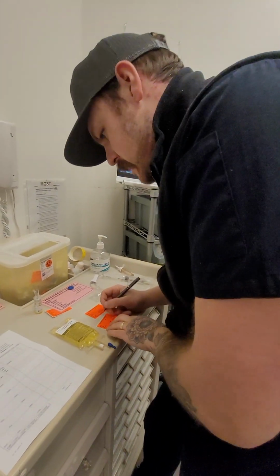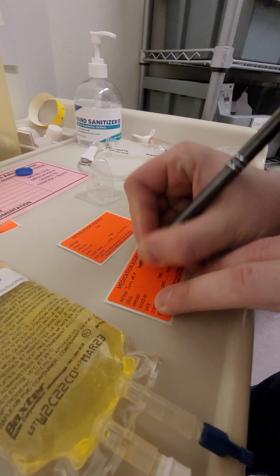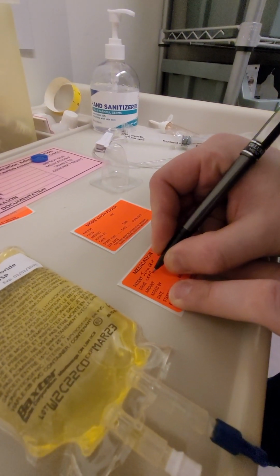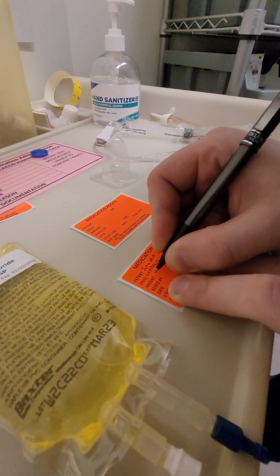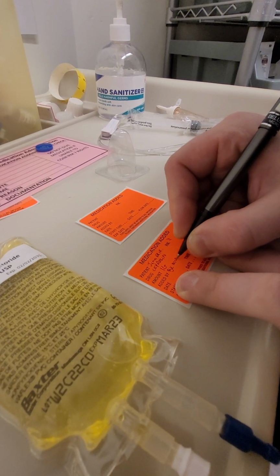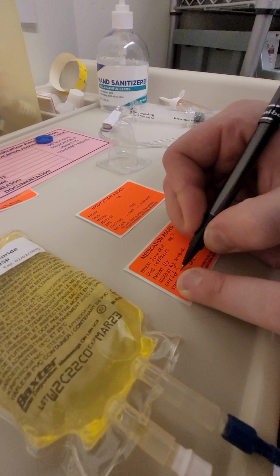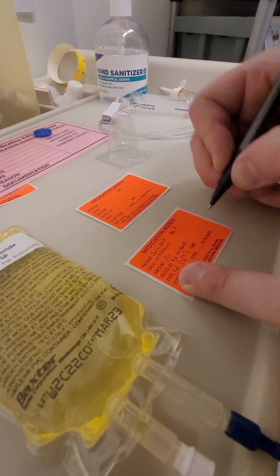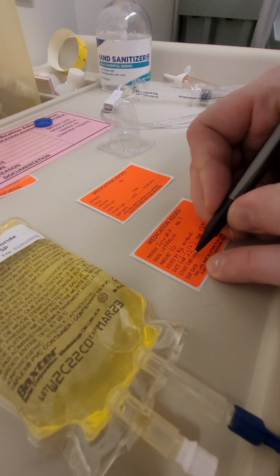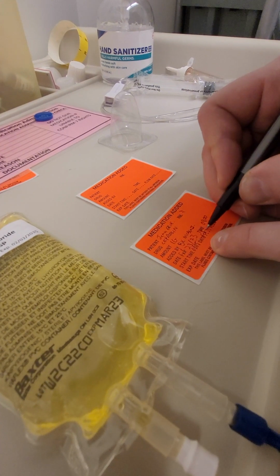So let's fill this out. So we've got generic here. Room 3, drug. We're going to be using cefazolin today. 1 gram. Added by myself, BK, NIC, BSN 2. Today's date, Feb 23rd, 23. Time, 8 o'clock. Start time, we're going to be probably 8:05 on that one. And date, same as today.